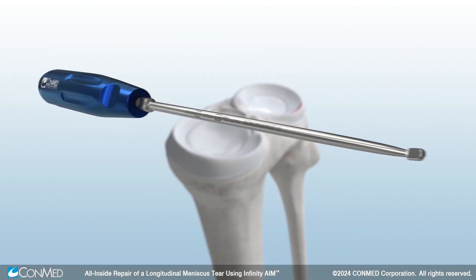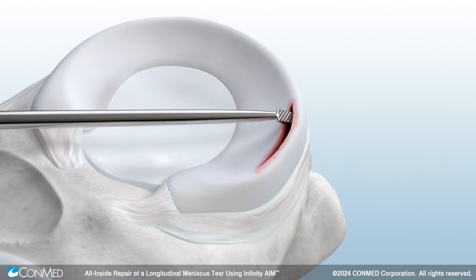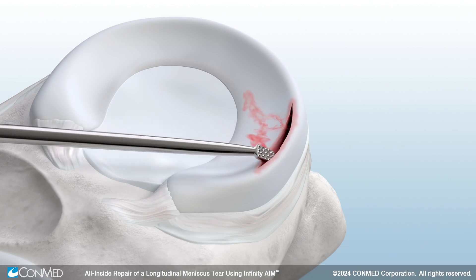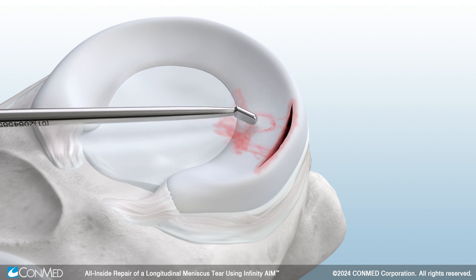Using a meniscal rasp, rasp the meniscus near the tear to stimulate blood flow and healing, continuing until blood is seen on the repair site to increase healing potential.